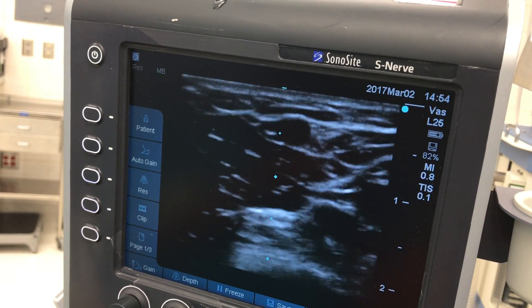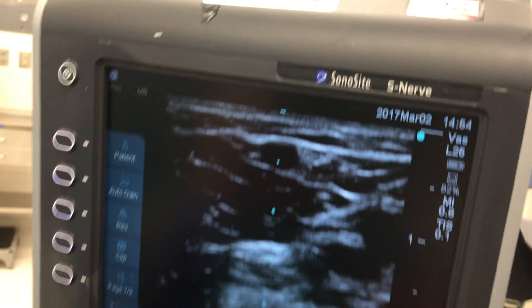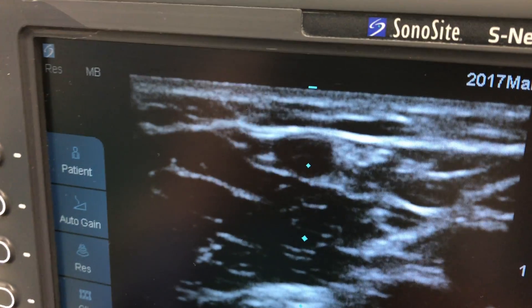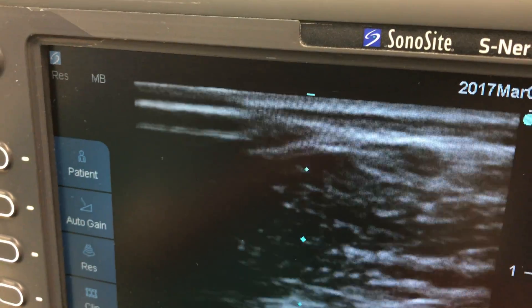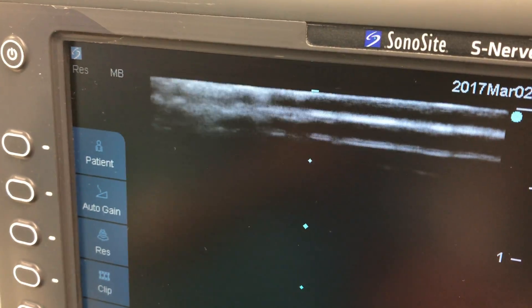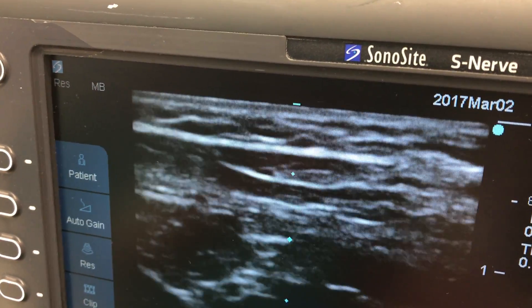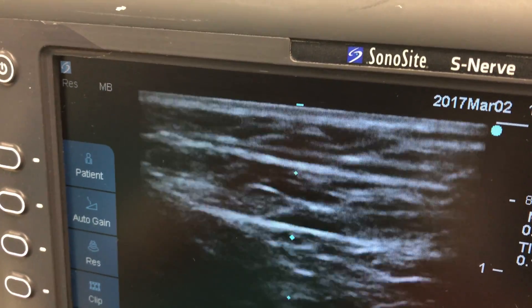It's important to try to make sure the vessel you choose runs straight. You can see there's one up here. I'm just going to increase the gain a little bit, which looks pretty good to me. I'm now going to turn the probe 90 degrees and see if I can find it.